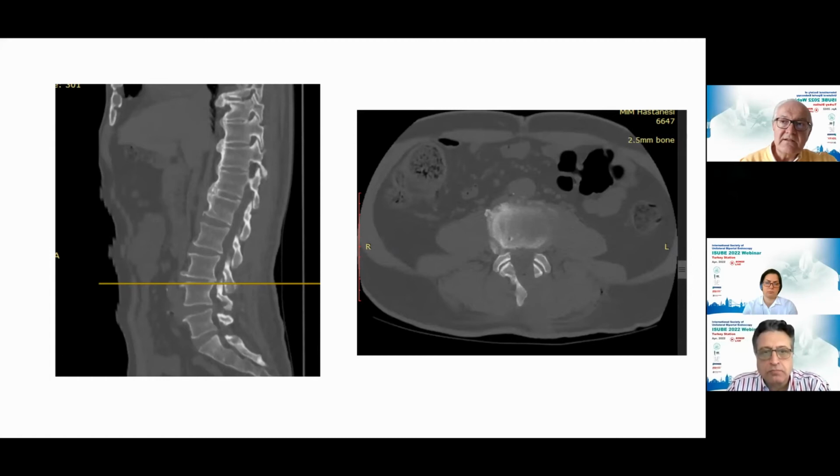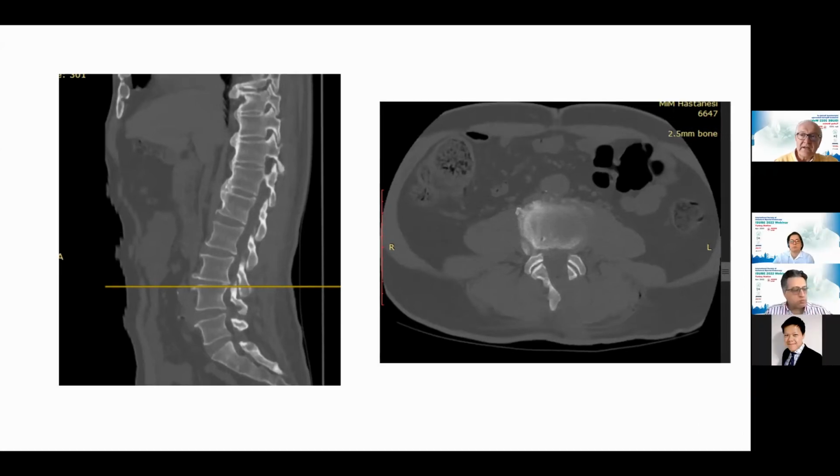Transcranial magnetic stimulation electroneuromyography system will show the localization of the compression, so it will be a very good support to the direction of the surgery, which levels. So the postoperative subjective or objective problems will be decreased, and the patient will be happy, because if it is necessary, we will do decompression. This is a very big chance, of course. Many thanks for your kind attention.